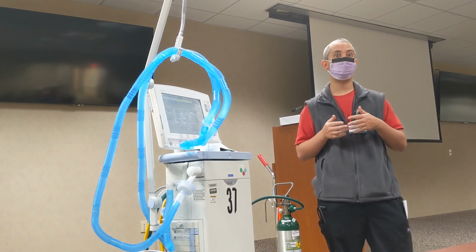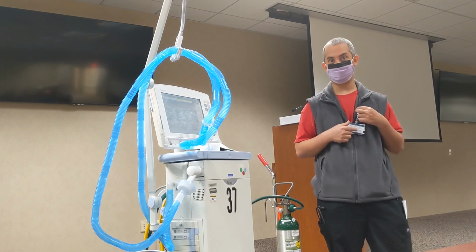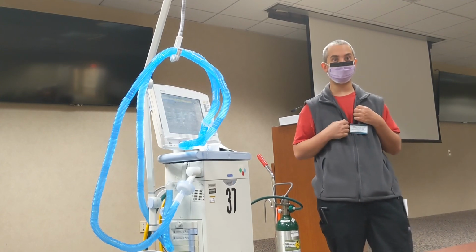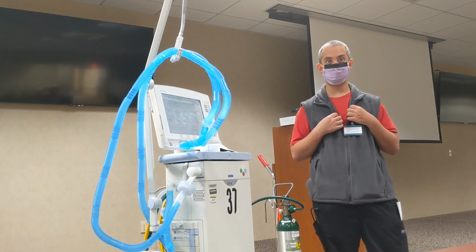I don't think so. If you're coming from 70% to 60%, I don't think it's going to help you very much. And even if you're going from a P high of 32 down to a P high of 30, I don't think that's going to make a huge difference either.